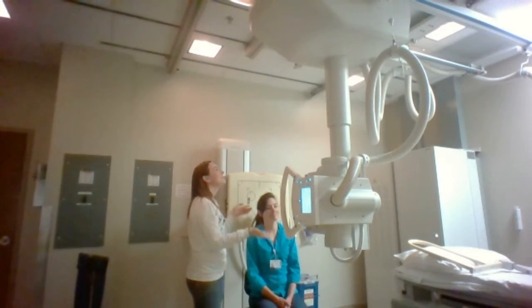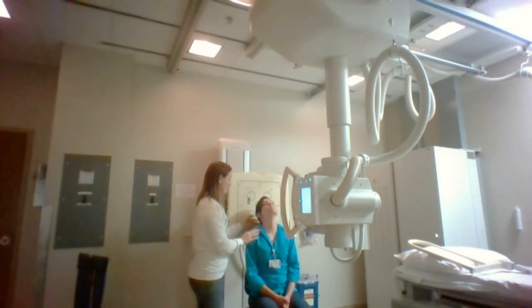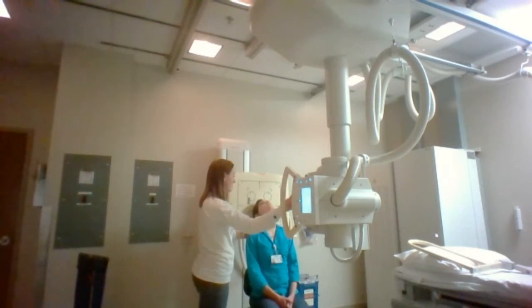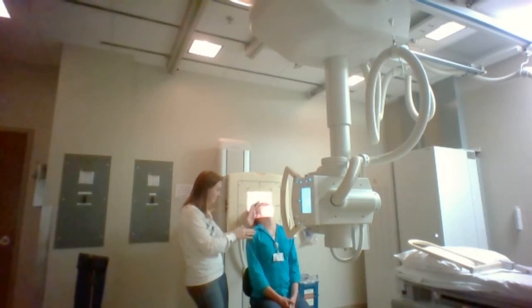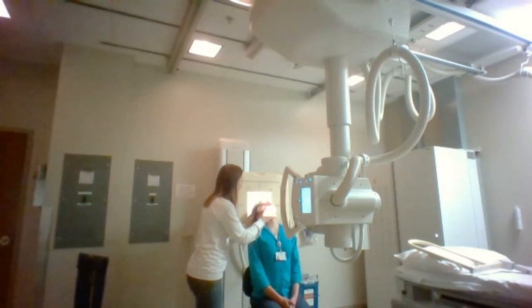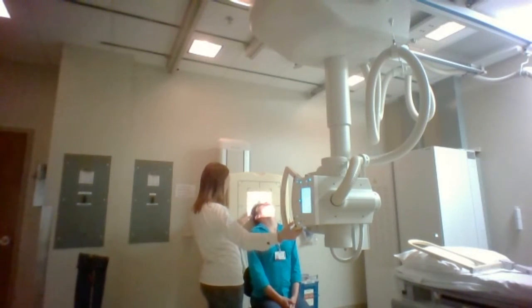What you want your patient to do is hyperextend their neck here, looking up, and I'm going to have you lean back. This is going to cause her IOML to be parallel with the IR here, like this. But it's important to have your central ray entering about 3/4 of an inch from the external acoustic meatus.